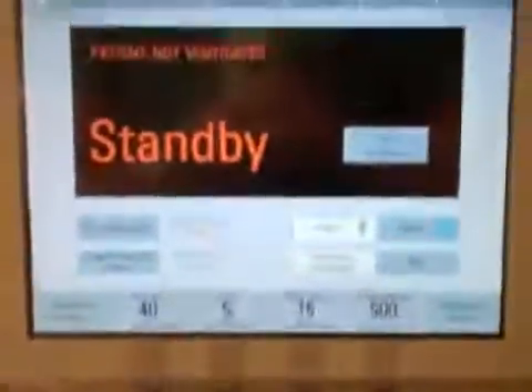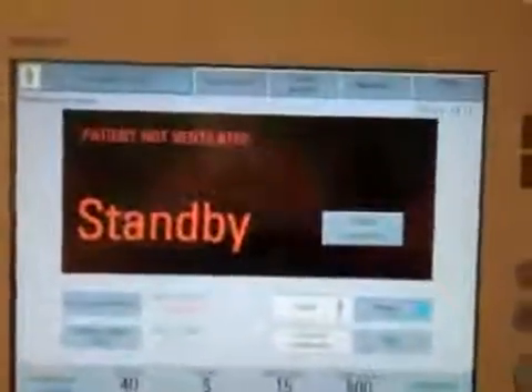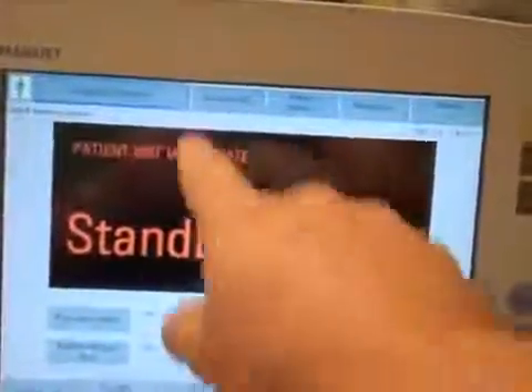Going ahead to start. It's asking if I want to delete patient trends and data — yes. Now here's the startup screen for the Servo-i. It has a very nice layout. In the top left of the GUI — the graphical user interface — you can see patient demographics, showing whether the patient is Adult, Peds, or Neo.